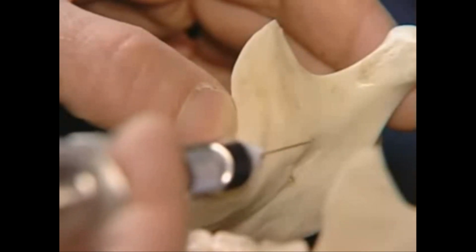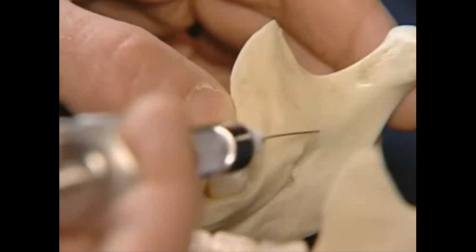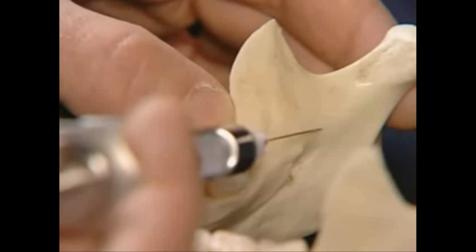The needle is advanced just behind the lingula until it hits the mandibular sulcus. It is at this point that the mandibular nerve enters its foramen.